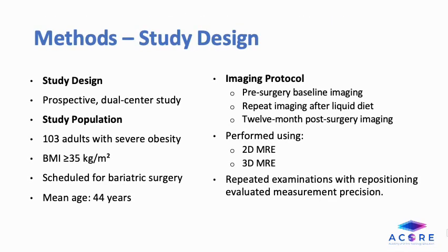This was a prospective dual-center study involving 103 adults with severe obesity who were scheduled for bariatric surgery. The average participant's age was 44 years old, and the majority were women. Participants underwent imaging at multiple time points, including baseline before surgery, after a preoperative liquid diet, and again 12 months following surgery. Both 2D and 3D MR elastography examinations were performed, and repeat scans with patient repositioning allowed the investigators to rigorously evaluate measurement precision.